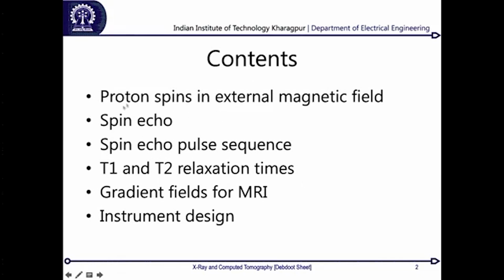From there I will enter into the spin echo and the spin echo pulse sequences, which help us do two very interesting kinds of imaging in T1 and T2, also called structural MRI. Up to here there is no image yet, it is just signals associated with the resonance of the small magnets within your body, which is caused again by the water itself.